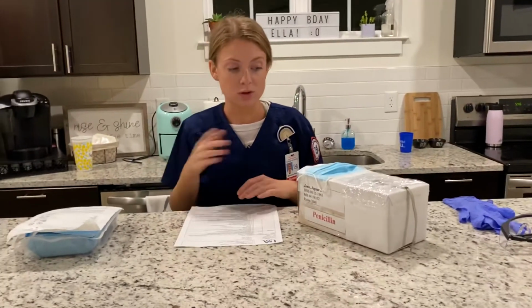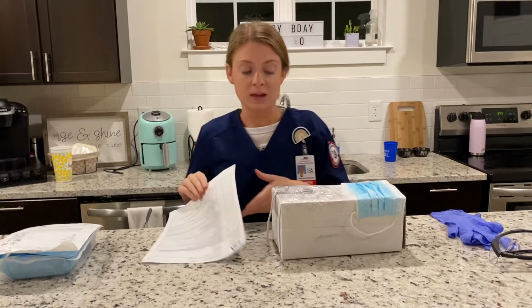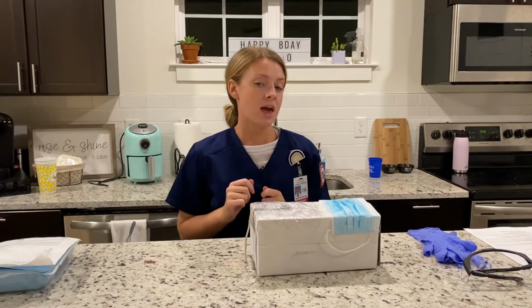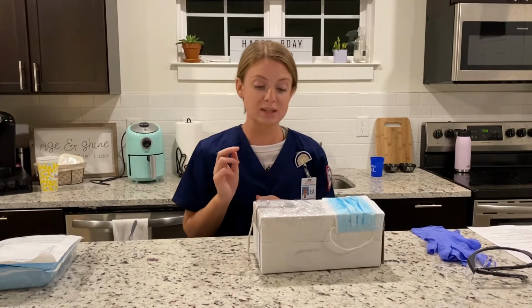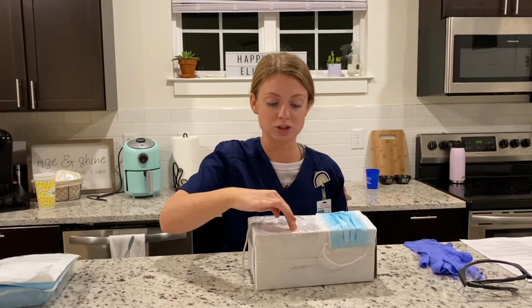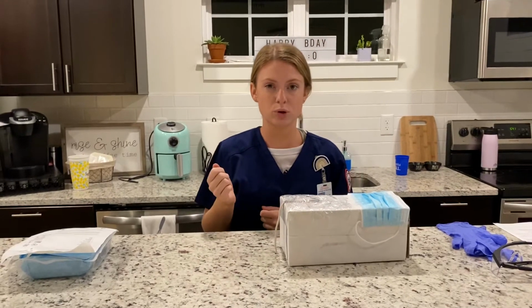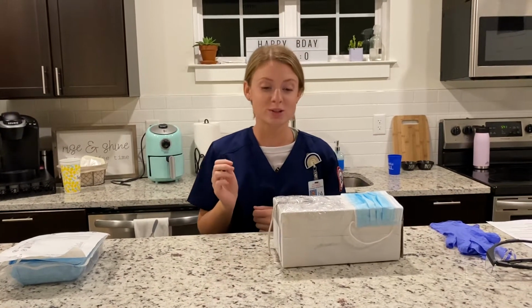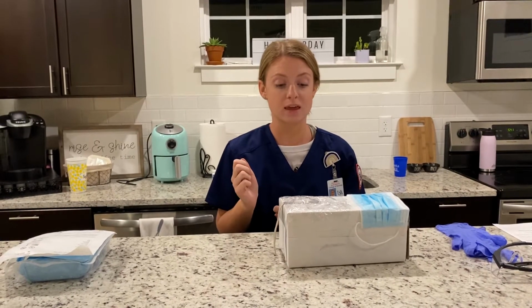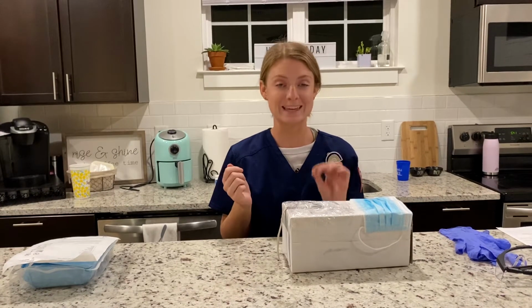And so I would also make sure he doesn't have any other allergies, and then I would explain the procedure to the patient and provide privacy. And so now I'm going to assess and palpate around the insertion site for the presence of any drainage, purulent odors, or inflammation, or a febrile patient. Then I would obtain a wound culture if indicated.